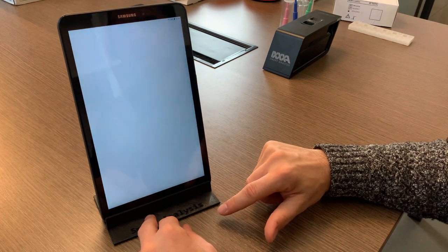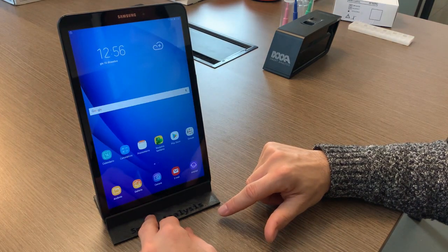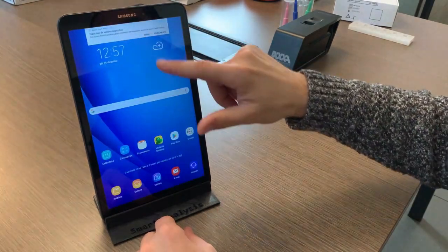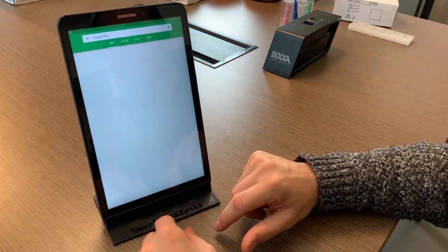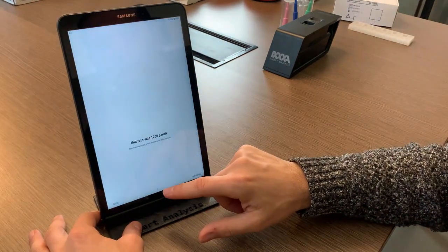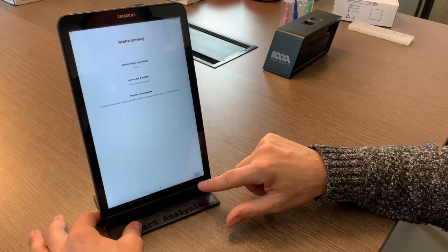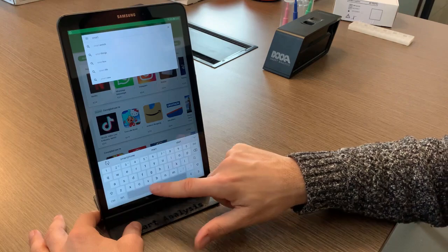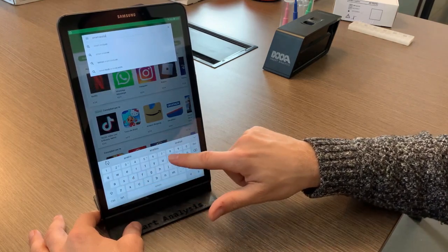Once you are done with the initial setting you are on the main page, at which point you can access Google Play Store and search for the Smart Analysis application, which you will recognize by its red icon.